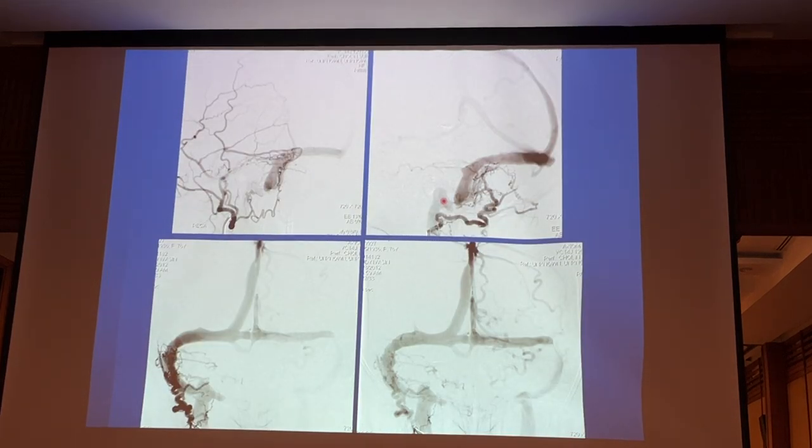And also, you have to remember there are septations in the sinuses. Ronnie Pilski published many years ago on a septated segment of the dural shunt. Rather than occluding the whole sinus, you can see this is a specific case.